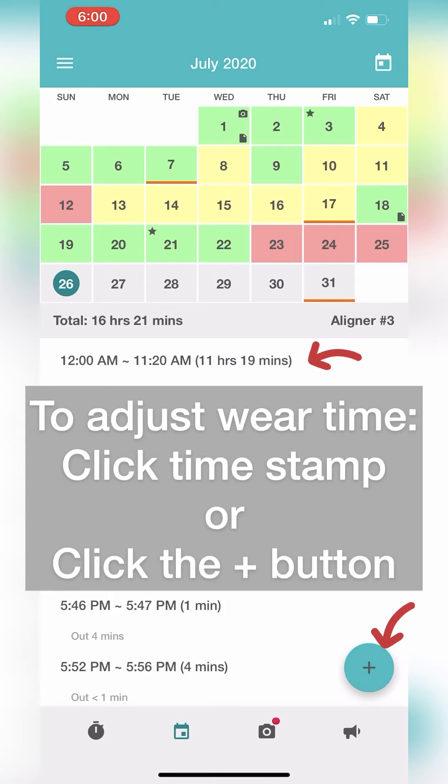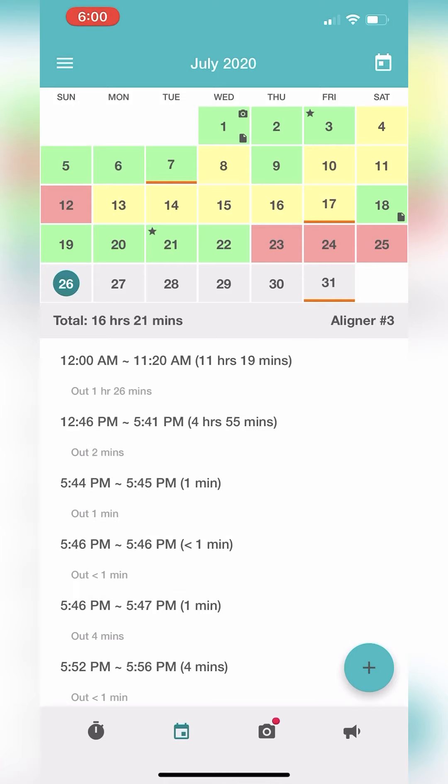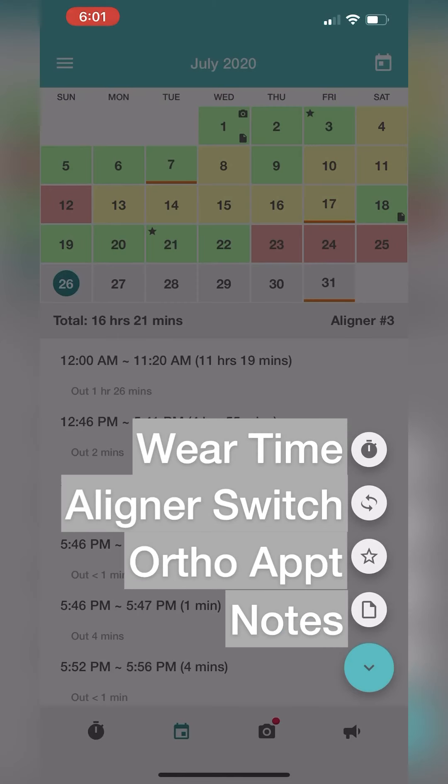In the calendar view, you can adjust your wear time by tapping on the timestamp below the calendar. This is helpful if you accidentally forget to start or pause your timer. If you tap on the plus button on the lower right-hand corner, you'll be able to add wear time, switch aligners, add an ortho appointment, and add a note to any particular day.